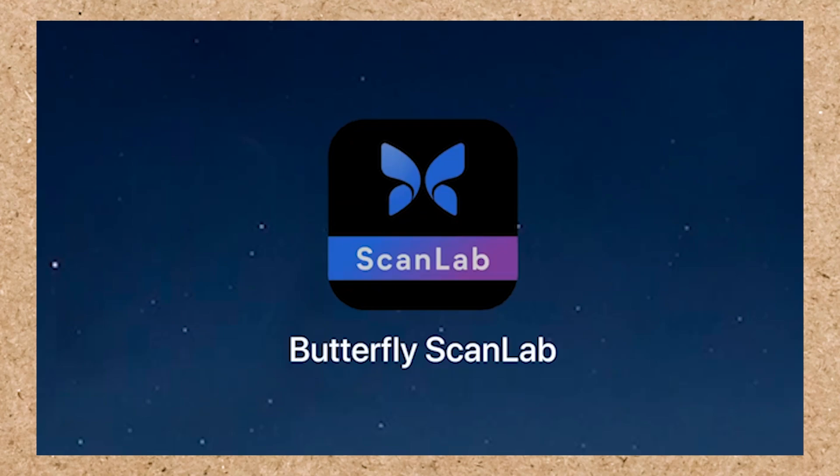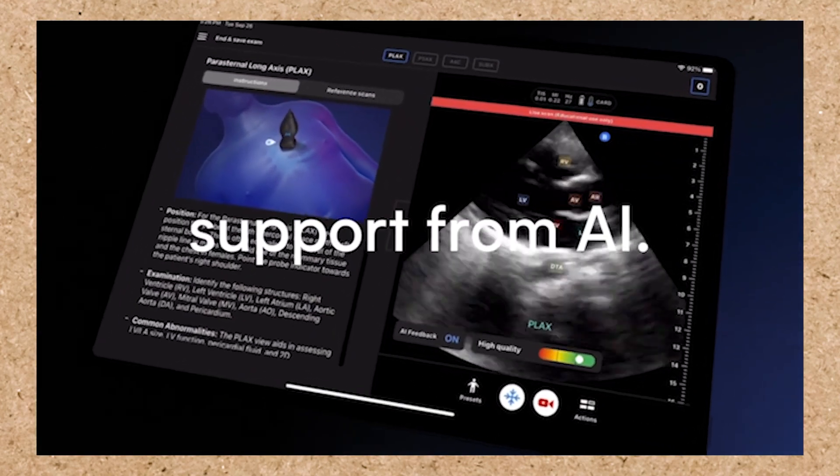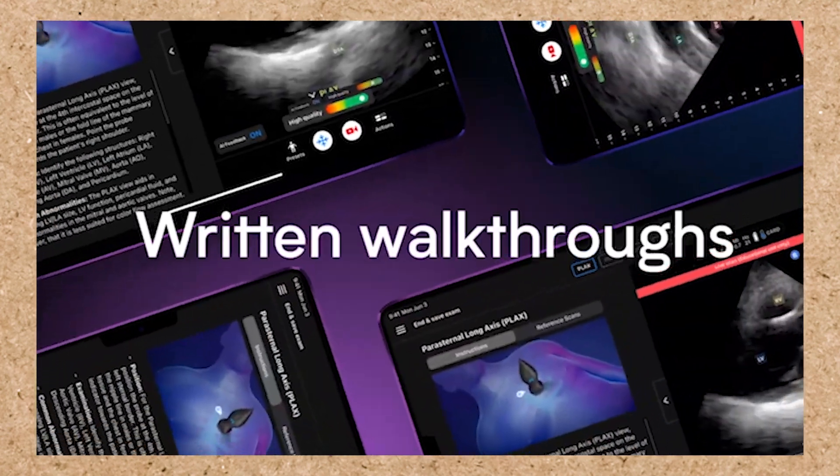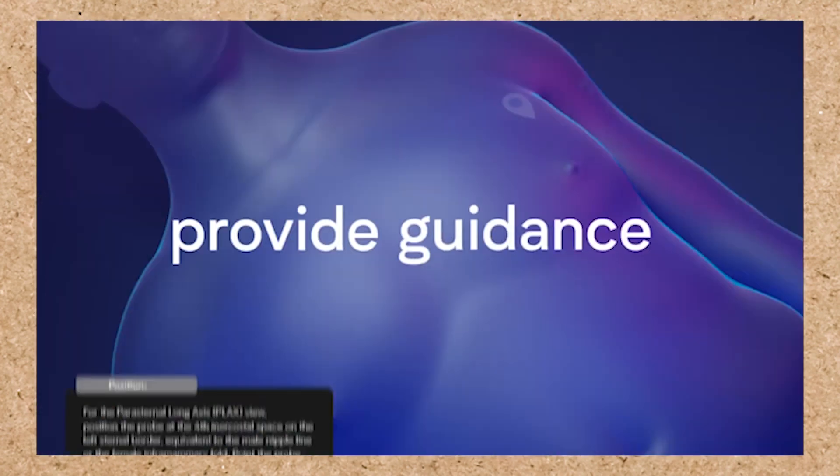One last thing I want to talk about is the new ScanLab with Butterfly. It's an app that uses AI technology to help you hone in on your scanning technique. Learning how to scan, especially on a new area that you would be focused on scanning — I think the Butterfly is a great system.